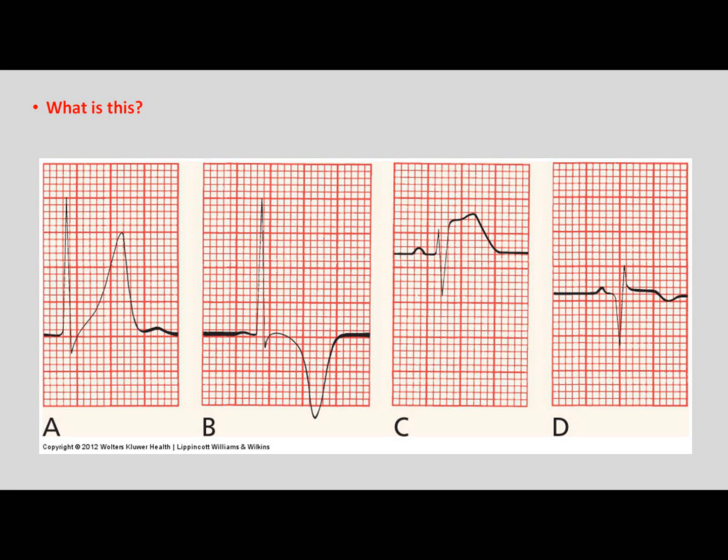Let's see. You. This young lady right there. What's this? Okay, what do you see? It's okay, don't feel shy. I'll help you. Okay, you look at the QRS. What's this? This is what? Peak T wave. T wave. Remember? QRST. Peak T wave.